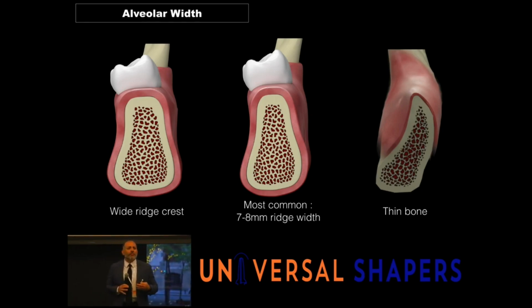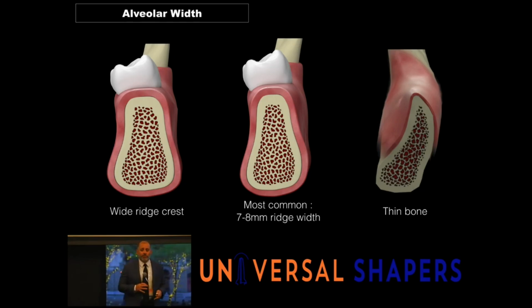But in general, there's not much we can do placing implants same day, unless we're trying to do, let's say, a ridge splitting type of scenario where we put the implants in simultaneously. But there are some risk factors with that. Those of you who have taken my ridge split course over the years, which was always offered at XP for many years, will know that I usually like to place my implants the same time that I do the ridge splitting procedure. But that's more complex.